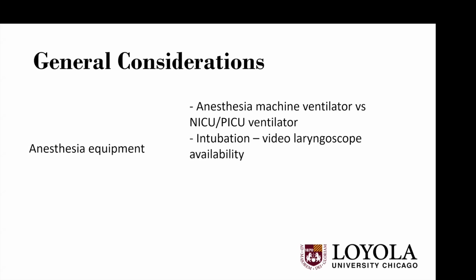You may be in difficulty, and you may have to wait for longer. So to have the video laryngoscope available in the catheterization lab is very important in case you are anticipating any difficulty with the intubation. Radiolucent EKG leads.